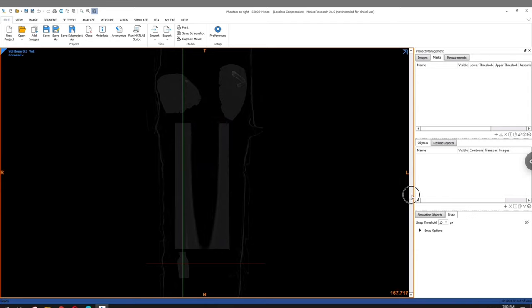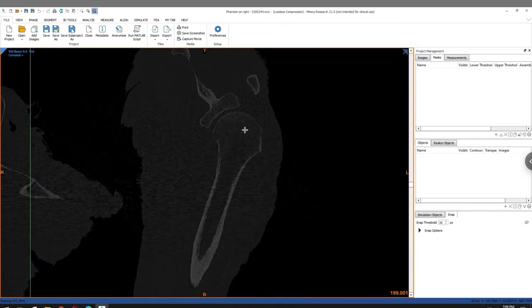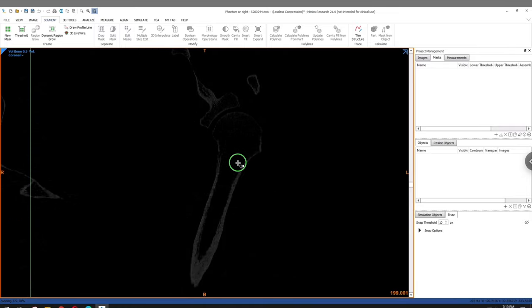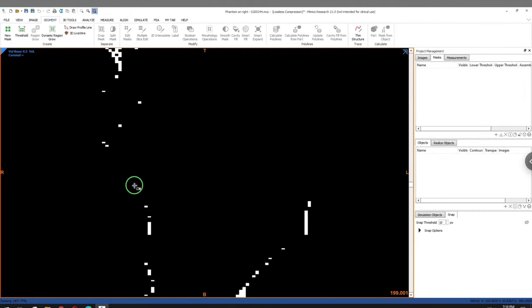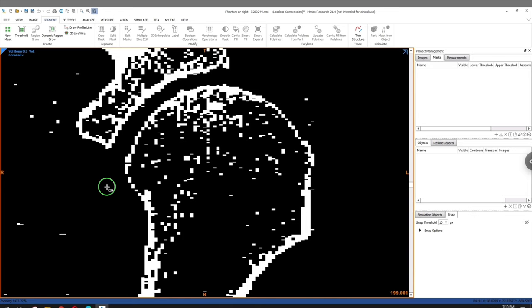Now, as we navigate through our CT images here, you can see on the scroll bar, and by using the scroll wheel, you can tab through all of the CT slices in the plane that you're working in. Using the control right-click drag function, you can zoom in and zoom out, and using the shift right-click drag function, you can pan through your image to help you navigate to exactly where you want to see.